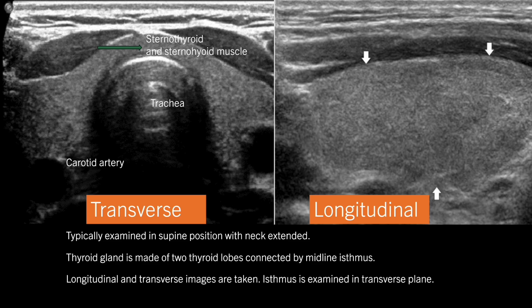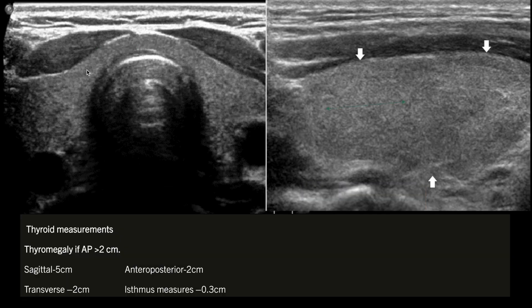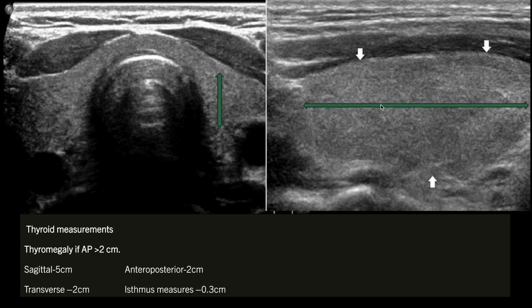Now let's talk about how to measure the thyroid gland. In this image we can take three different measurements: sagittal, transverse, and anterior-posterior. The sagittal measurement is the longest, and normally the sagittal length is five centimeters. In this image, the anterior-posterior length is shown — if this is more than two centimeters, we call it thyromegaly.